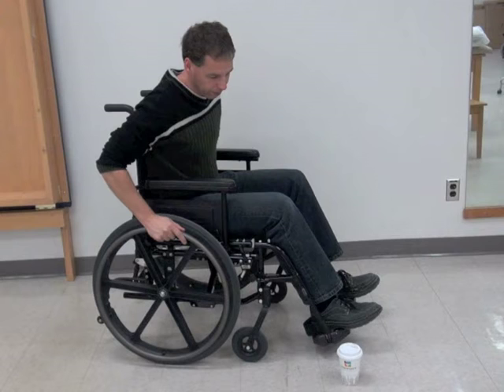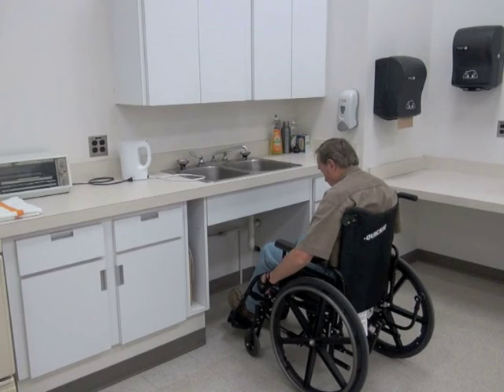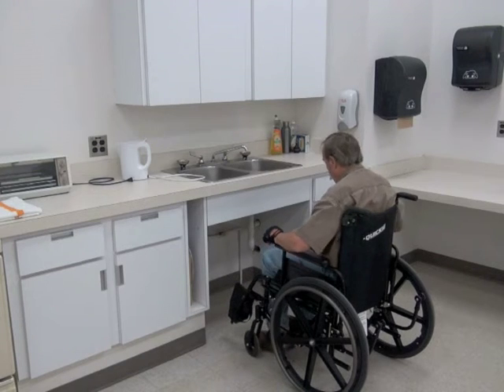If you are reaching forward with your right hand, use your left hand to hold on to the wheelchair for balance and support. Holding the armrest or sliding your hand or arm behind the backrest is a good way to secure yourself when reaching ahead. If you are able to lift your feet off the footrests and place them on the floor, it is both easier and safer to reach forwards towards the ground.